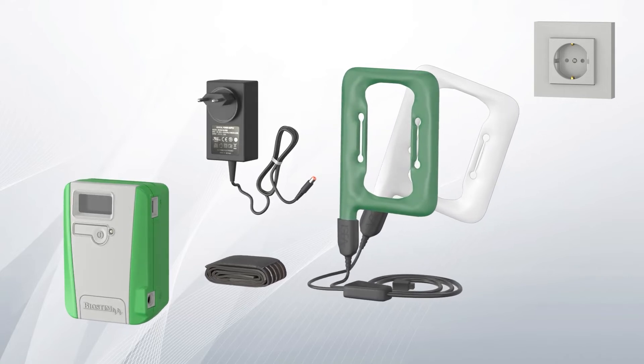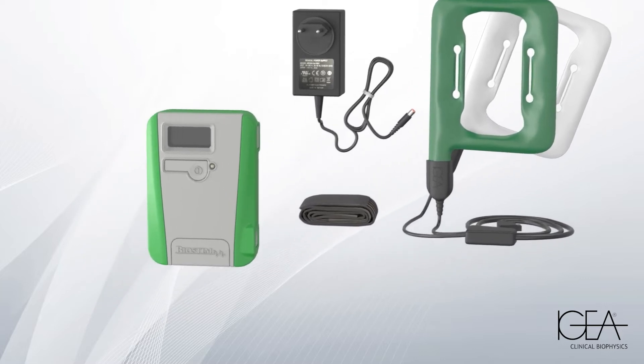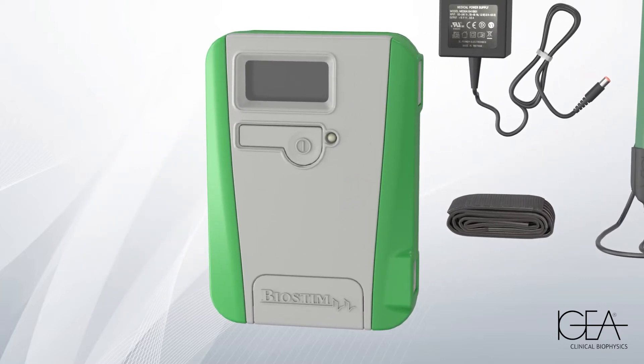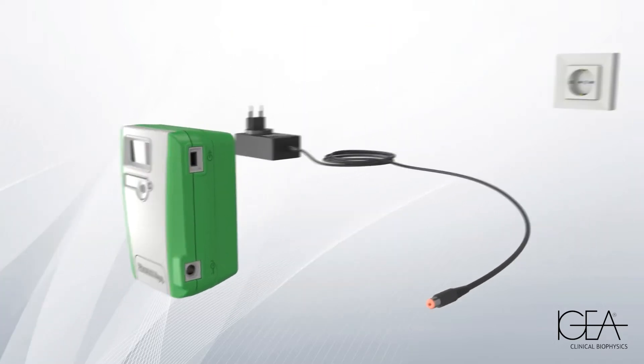Biostim is a medical device capable of accelerating the healing of a fracture, shortening recovery times and reducing the complication rate. It is very simple to use. To fully charge the battery, connect the generator to the charger.